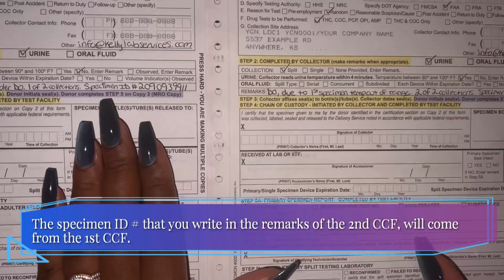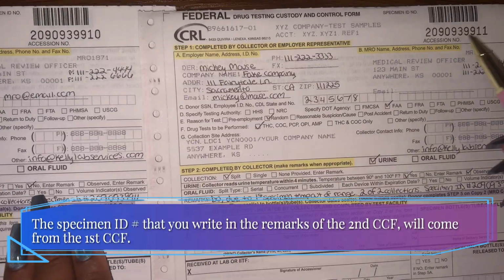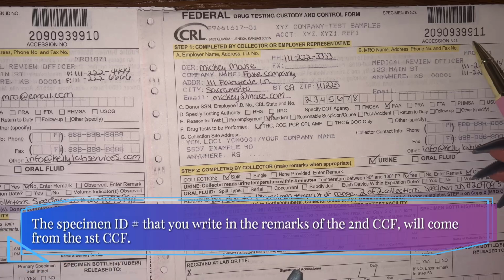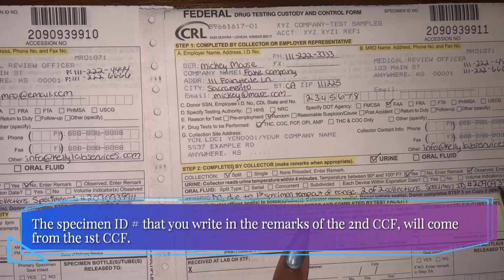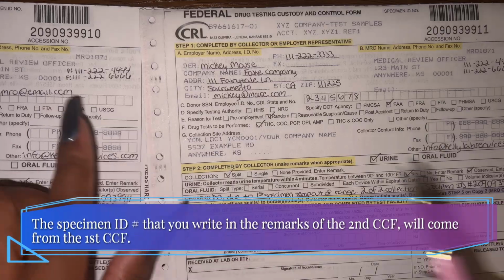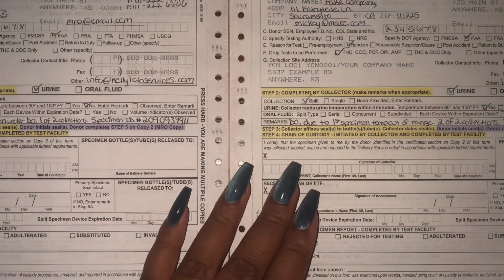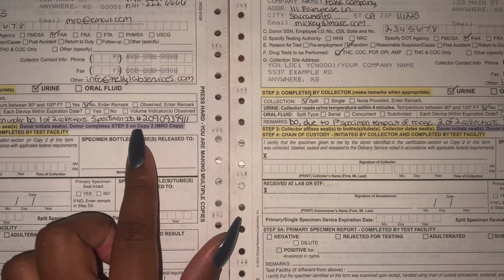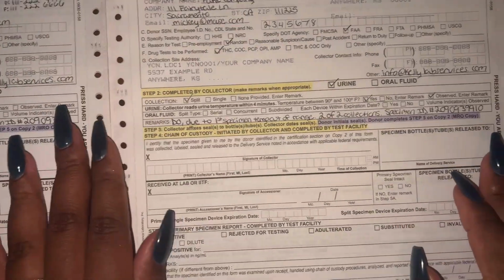So as you can see, on our first CCF, we have this specimen ID number from our direct observation. And on our direct observation, we have this specimen ID number from our temp out of range CCF. So anybody that looks at this paperwork is going to see the two specimen ID numbers are cross-referencing each other on each set of CCFs, your temp out of range and your direct observation.